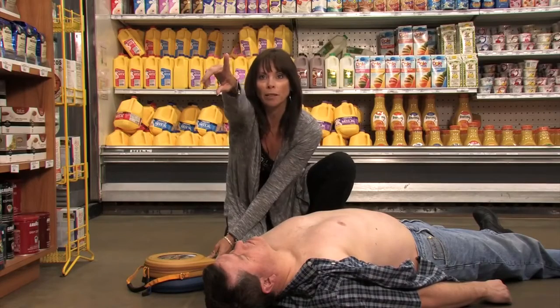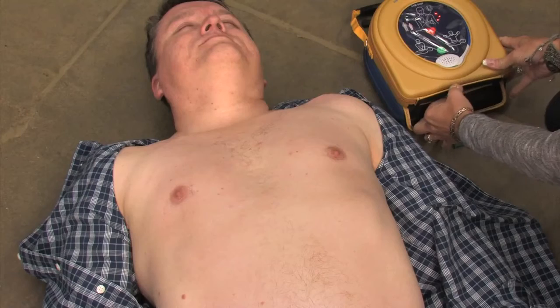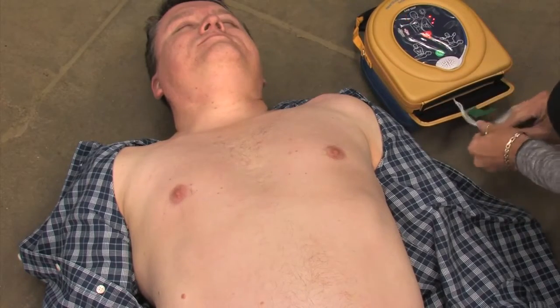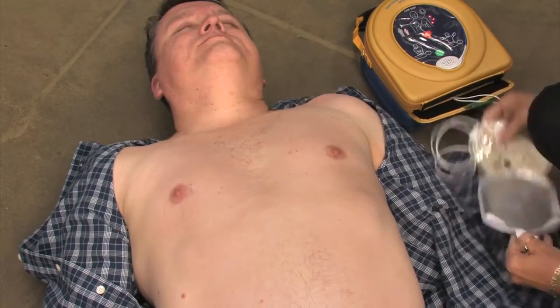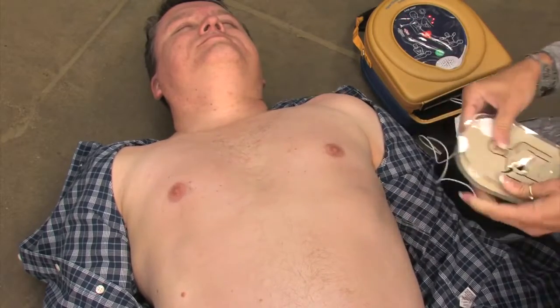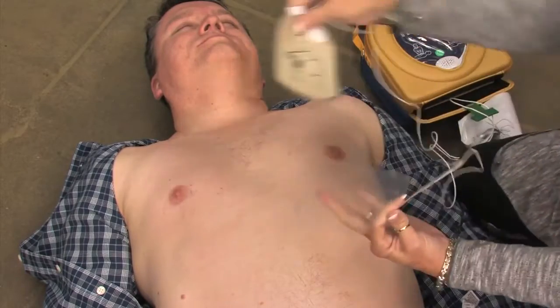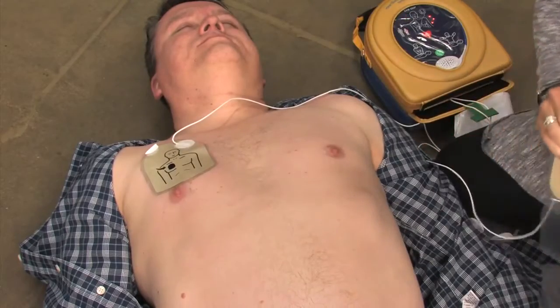Call for medical assistance. Did you call 911? Remove clothing from the patient's chest to expose bare skin. Pull the green tab to remove pads. Peel pads from liner. Apply pads to the patient's bare chest as shown in the picture.